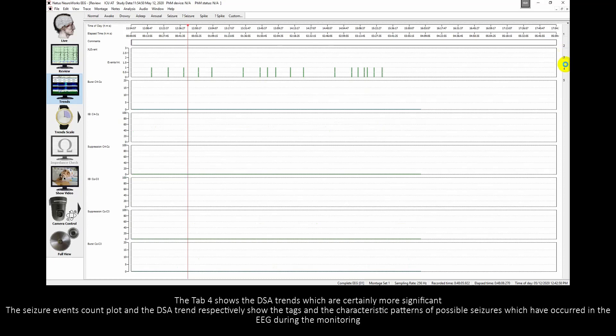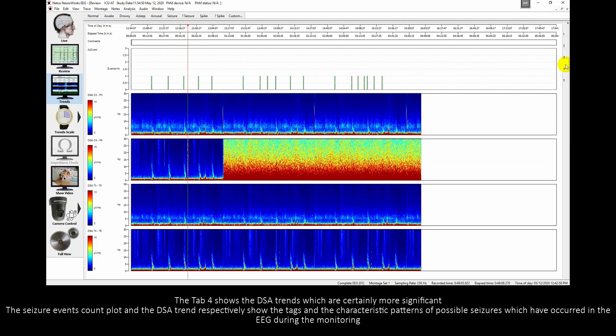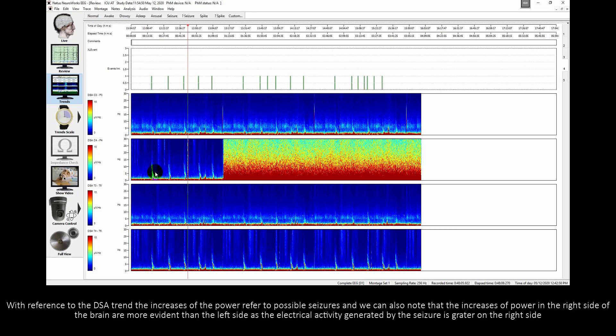Tab 4 shows the DSA trends which are certainly more significant. The seizure events count plot and the DSA trend respectively show the tags and the characteristic patterns of possible seizures which have occurred in the EEG during the monitoring. With reference to the DSA trend, the increases of the power refer to possible seizures and we can also note that the increases of power in the right side of the brain are more evident than the left side as the electrical activity generated by the seizures is greater on the right side.